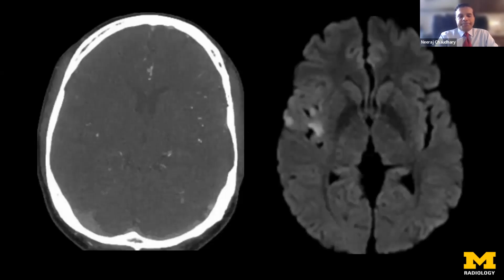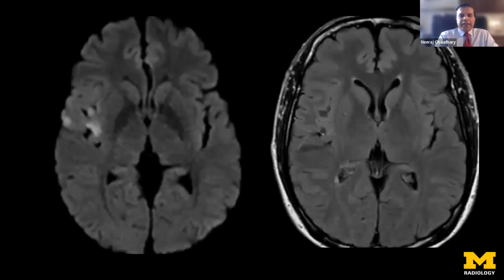about MRI. Here on the CT angiogram, we're seeing there is decreased perfusion in that right side of the brain. And we can see here on diffusion weighted sequences on MRI, which is basically a sequence which picks up ischemia, these bright segments, bright spots in the insular area, in the opercular area. And these are suggestive that there is hypoperfusion, there is ischemia.